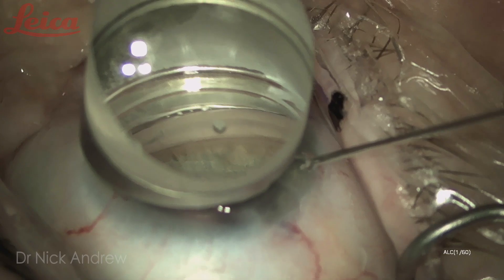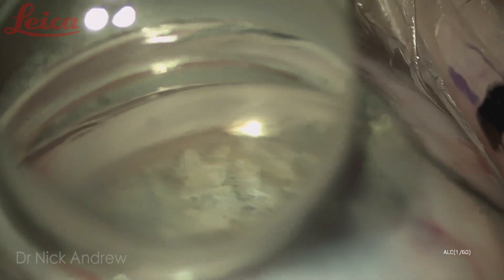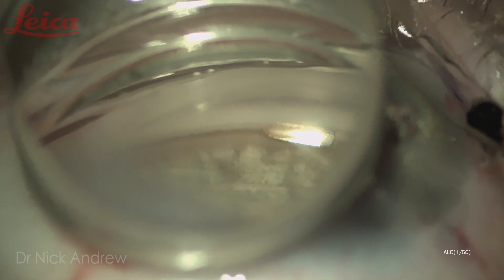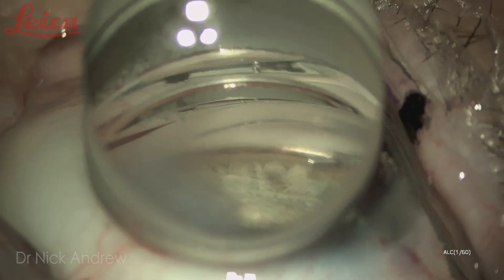Here are a few demonstration cases. I'm beginning this case by piercing the trabecular meshwork as far to my right as possible — even up under the upper eyelid. Opening the speculum more widely; you don't want the speculum pressing on the limbus. I'm piercing the trabecular meshwork far to my right and pushing forwards, burying the distal one-third of the hydrus injector beneath the trabecular meshwork, well and truly seated deep in Schlemm's canal. Then relaxing the hand — the eye comes around to a neutral position — and making a steady delivery.